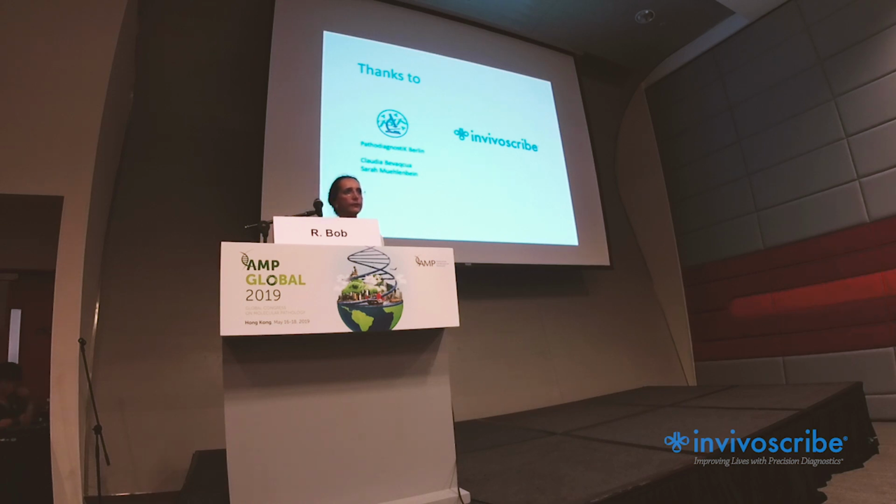How many of those results are correlated with your flow cytometry results? We don't apply flow cytometry in our lab. It's a tradition in Germany that fluid material goes to hematologists, and we get the formalin fixed and paraffin embedded tissue. So it's not often that we apply flow cytometry.